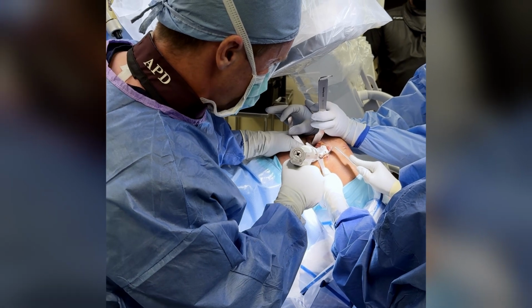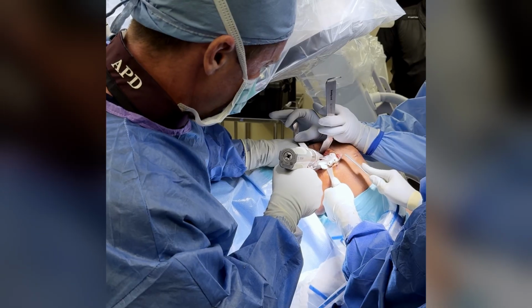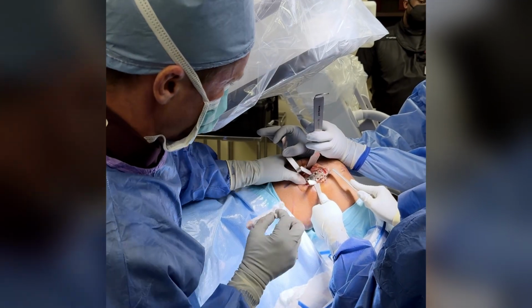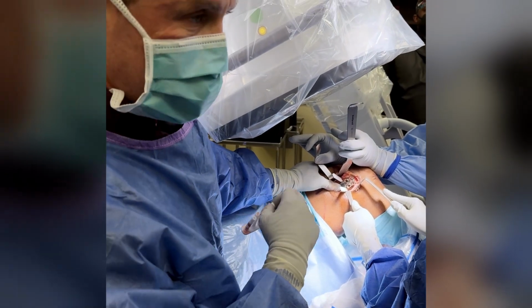This is the same drill for every hole. So I just go through all of these holes with my drill, holding the guide in place. And once that's done, we've created the holes through our plate with the plate in position. So next we're gonna put the screws in, and that's about it.